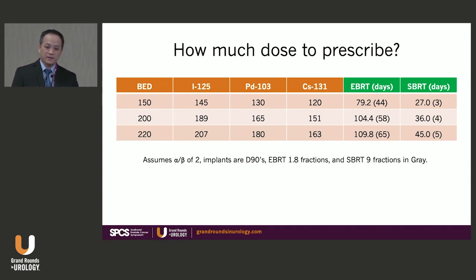From here, as Dr. Stone showed earlier, the external beam dose is much higher than the regular dose you see here. It's almost 40% higher. Think about it: you need to deliver a much higher dose than the regular Linac dose. You need 40% more, you just need to add 40% more MU. But if you look at the Dr.